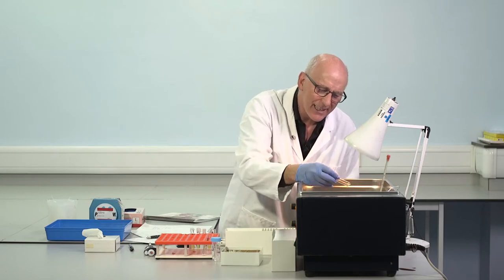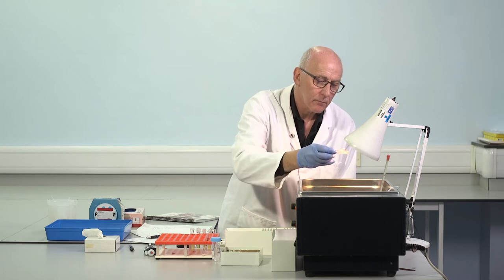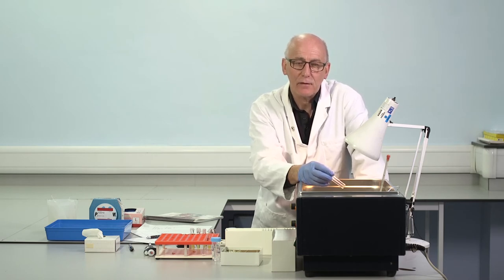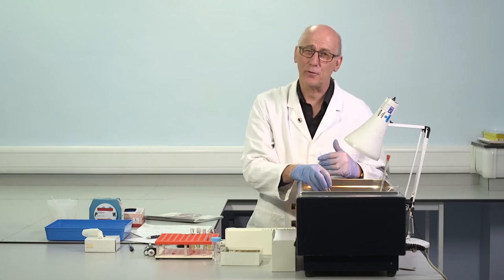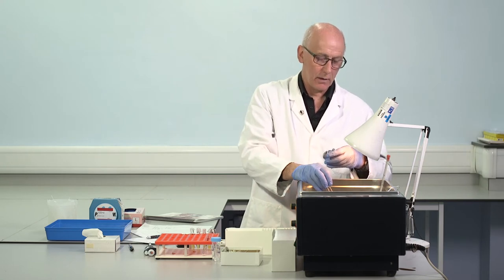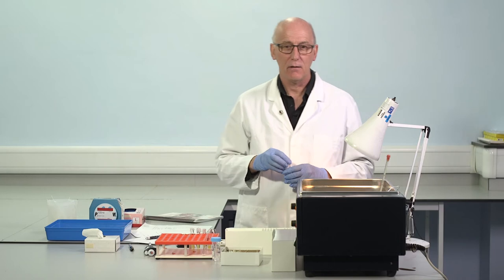And the clot that forms, it's still a clear change. It's a slightly slower process. So in the weaker clot at this longer time, the clotting process is more drawn out over 3, 4 seconds sometimes. And sometimes people will say, so what do I call it? Which is my endpoint? Is it the beginning of that process? Is it the end? It's not so important, of course, because the clotting time we've obtained here on the first duplicate is 116 seconds, and on the second one is 113 seconds. So I'm going to write that down whilst I remember. So 116, 113, so 3 seconds difference.